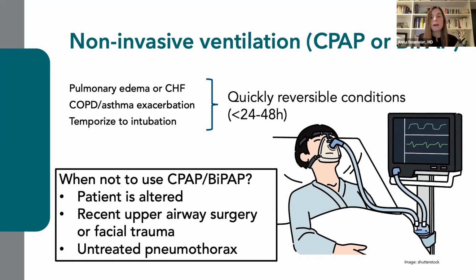Similarly, CPAP and BiPAP should not be used if the patient is altered, unable to protect their airway or their secretions, if they have recent upper airway surgery or facial trauma, or if there's an untreated pneumothorax.